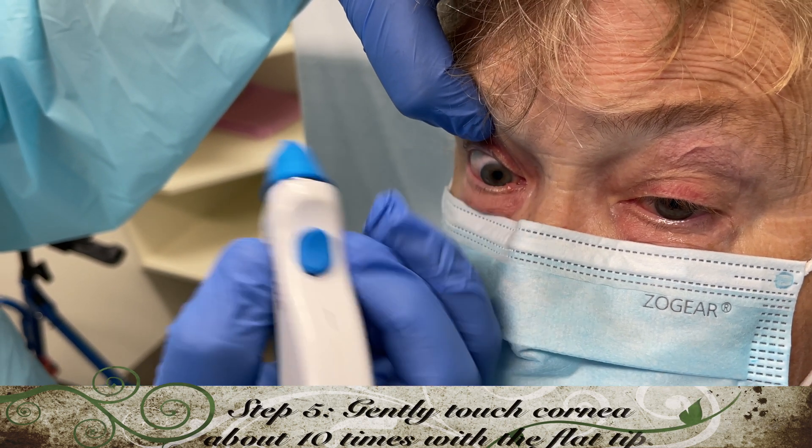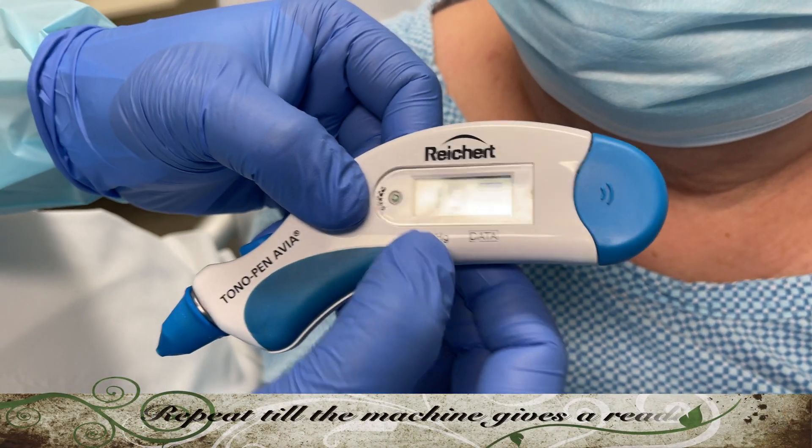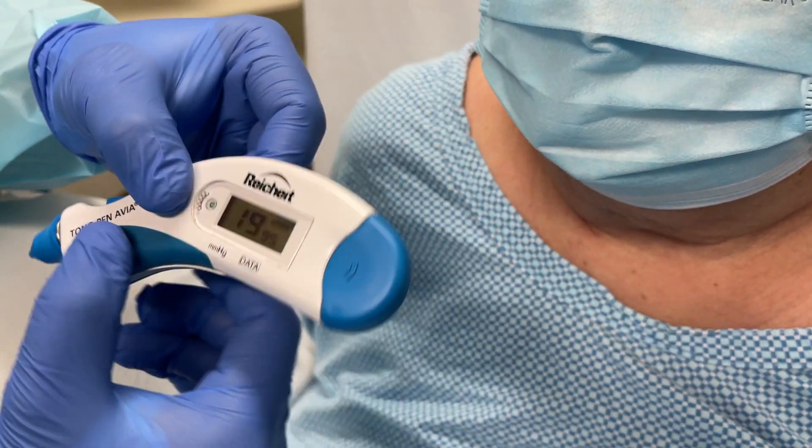Lift the upper eyelid and touch the tonometer pen gently on the numbed cornea about 10 times. The machine will give you an averaged reading. This reading is 19mm of mercury with 95% confidence.